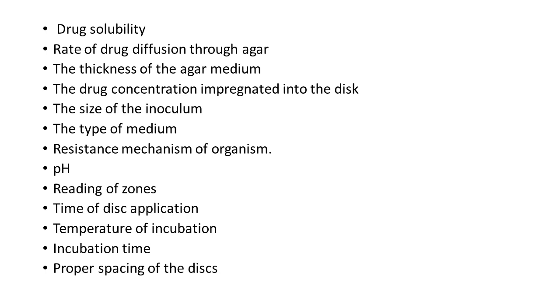Drug solubility, rate of drug diffusion through the agar, the thickness of the agar media, the drug concentration impregnated into the disc, the size of the inoculum, the type of the medium, resistance mechanism of the organism, pH of the medium, reading of zone, time of disc application, temperature of incubation, incubation time, and proper spacing of the discs. These are the factors that influence the zone size.